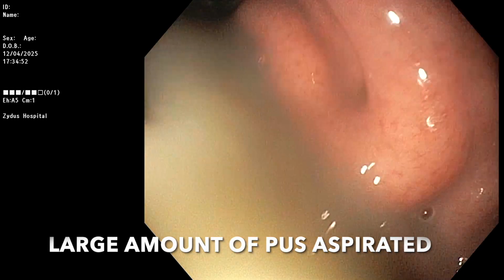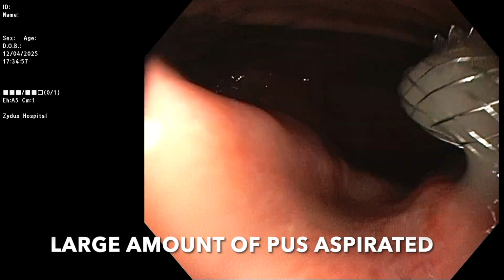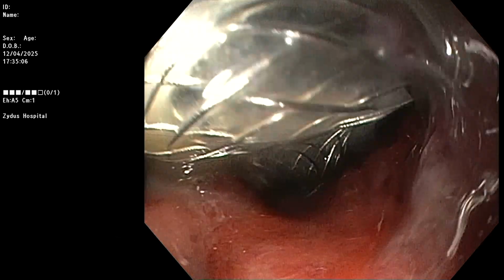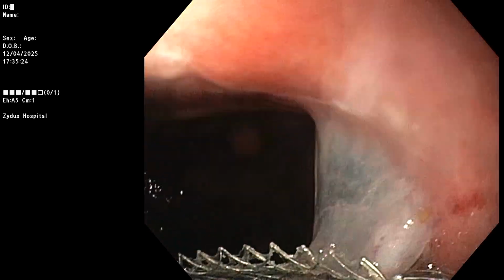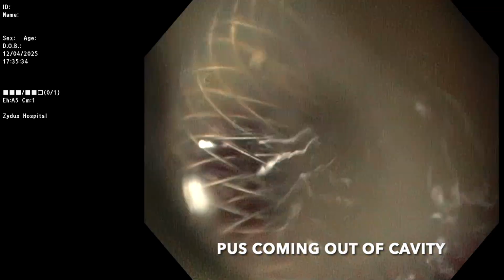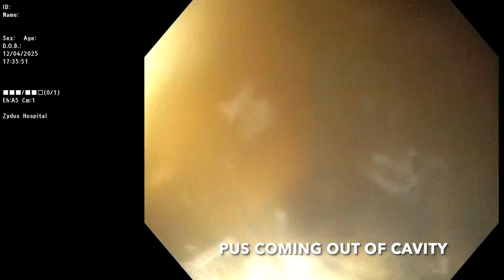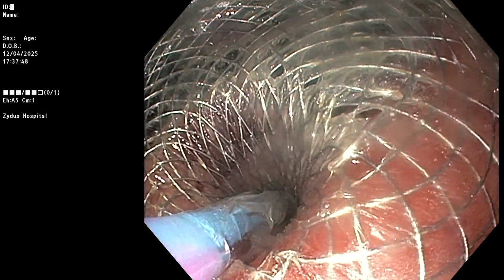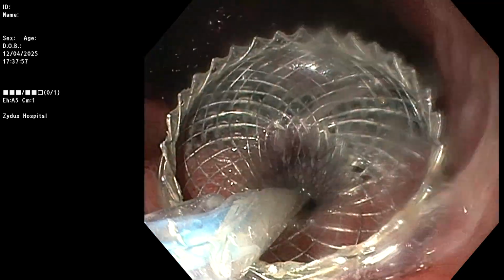Generally we do this procedure under anesthesia. Patient is intubated so as to prevent any kind of aspiration. A large amount of pus was aspirated from this patient, and you can see the stent which is properly placed. We are trying to see inside and still a significant amount of pus is coming out of the cavity. Now once this step is done, next step is either you leave this stent and try to dilate in the next session, or you can dilate even in the same setting as we are doing.